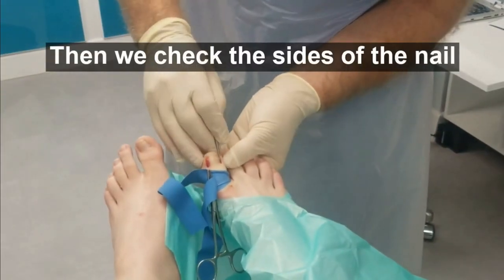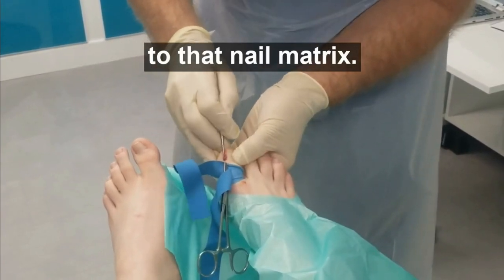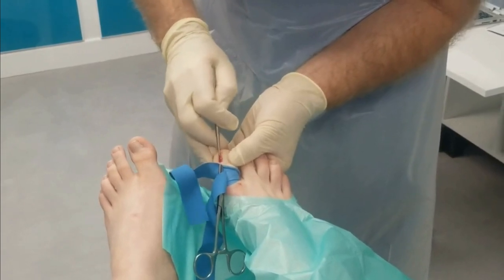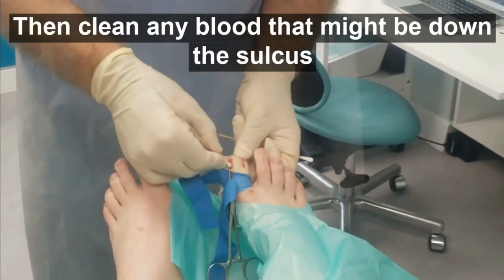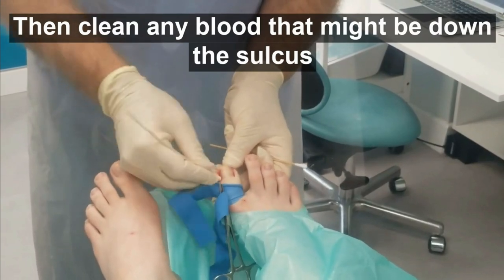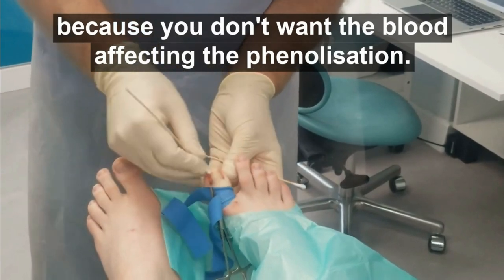We check the size of the nail — making sure we've got all the way down to that nail matrix. Then clean any blood that might be down the sulcus, because you don't want blood affecting the phenolisation.